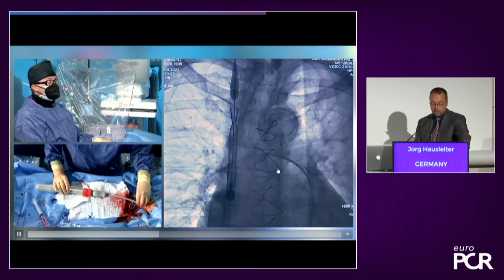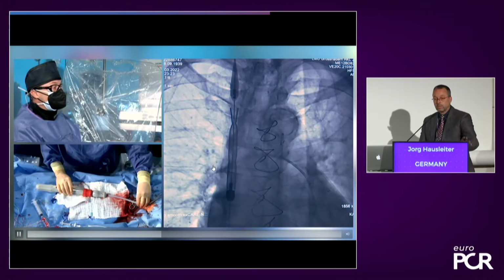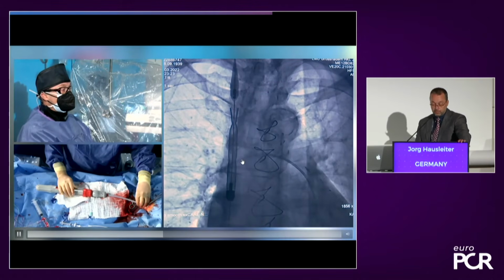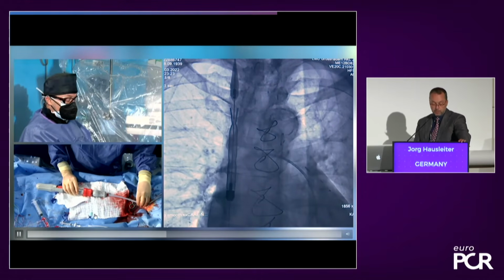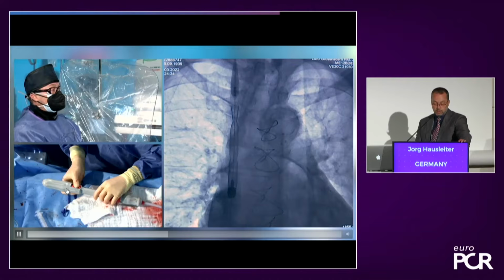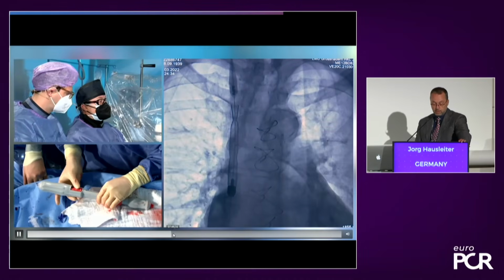The pulmonary catheter serves, as I said, as the other landmark, so that we want to be above this pulmonary artery catheter, so that the valve is not dropping below the pulmonary artery catheter. So this gives us a little bit more additional stability of the valve. Then the procedure is rather simple, as you will see. Just by pulling this wheel here, we're going to unsheath the stent. This is being performed in several steps.